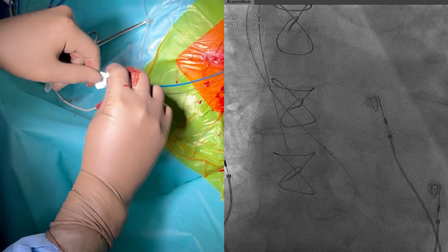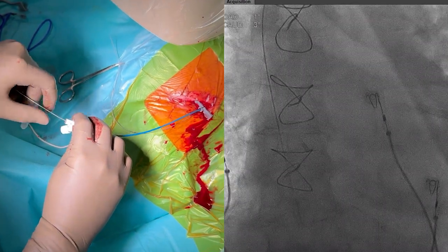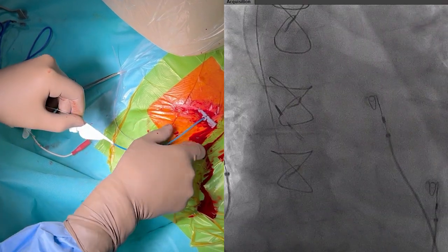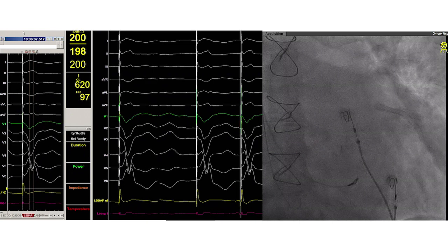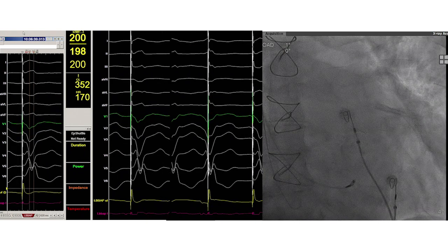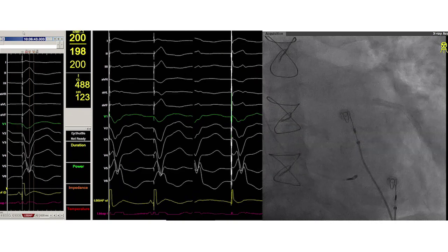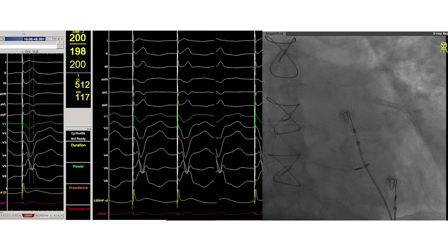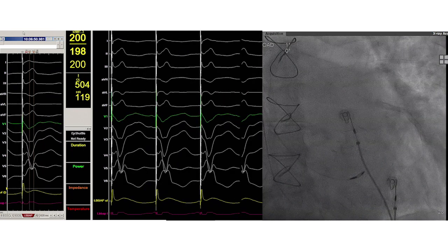Note that this lead has an extended and fixed helix. It is very thin when compared to conventional pacing leads. The lead can now be introduced while making sure that the distal end does not exit the guiding catheter. Unipolar pacing helps in finding the area of interest, showing a W pattern in lead V1. On the fluoroscopy we can see that the lead tip is against the high basal septum.